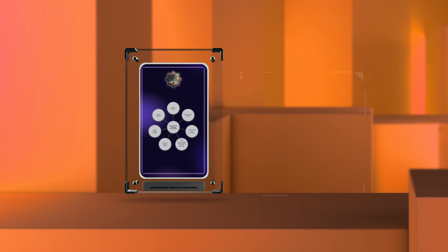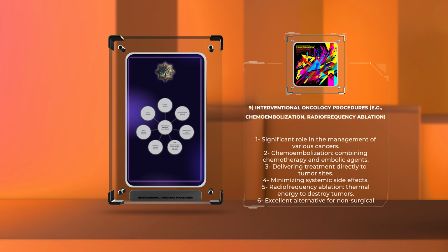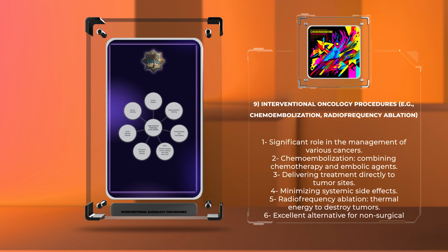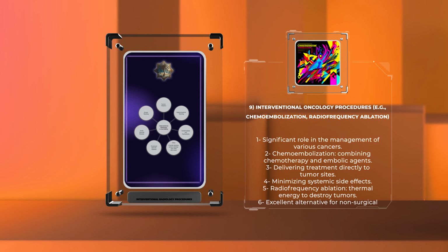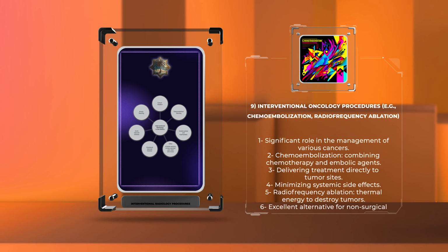Interventional radiology plays a significant role in the management of various cancers. Chemoembolization combines chemotherapy agents with embolic agents, delivering a potent treatment directly to tumor sites while minimizing systemic side effects. Radiofrequency ablation involves using thermal energy to destroy tumors, providing an excellent alternative for patients who are not surgical candidates. These procedures are transforming the landscape of cancer treatment.